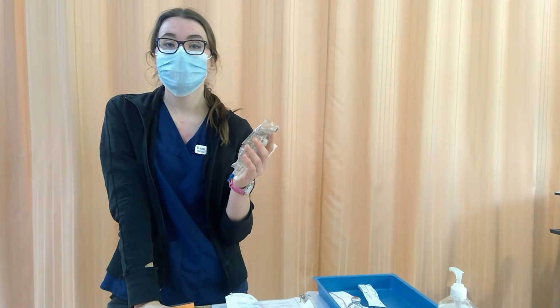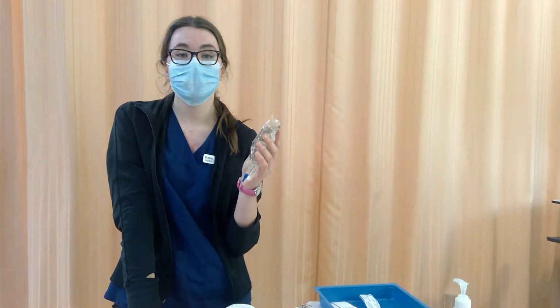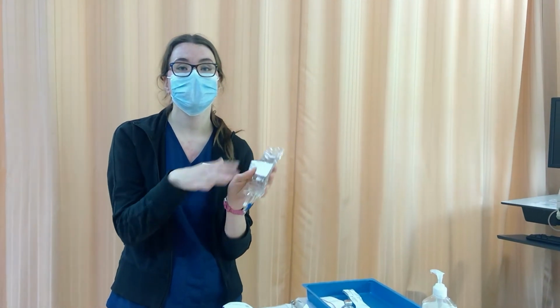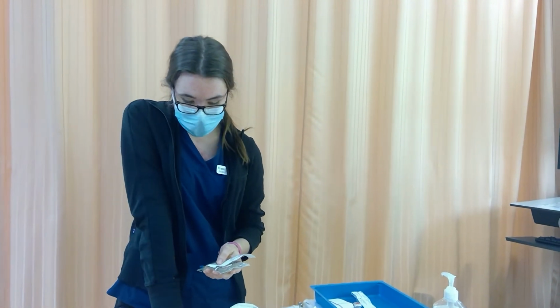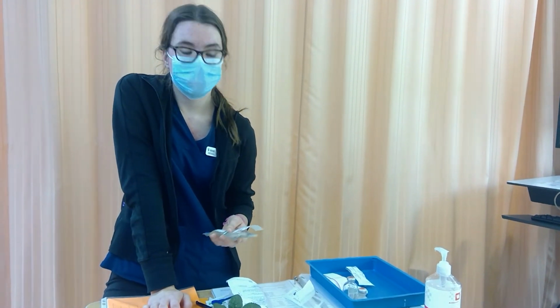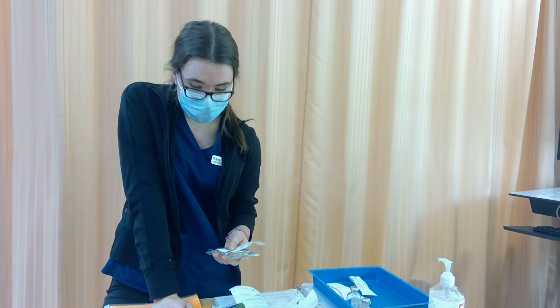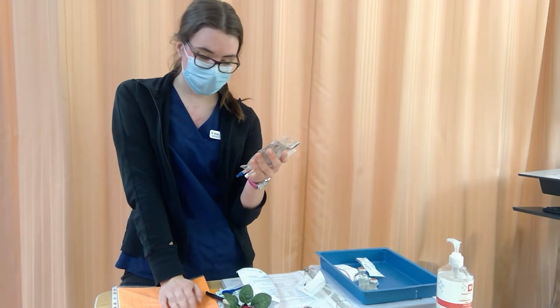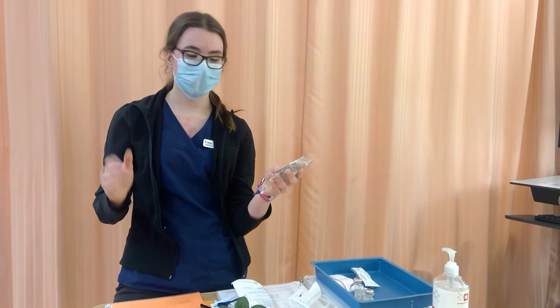Like we said, we drew up half of what we reconstituted in the vial, so this is the correct dose, and we inserted it into 100 milliliters of normal saline, so we diluted it, okay? And correct route, IV, this can be given by mini bag. We verified that with the PDM. And every 6 hours, it's 12 o'clock, so it's due right now, so we're going to be giving this medication. So it's at the correct time, everything is okay, we've done all of our checks.